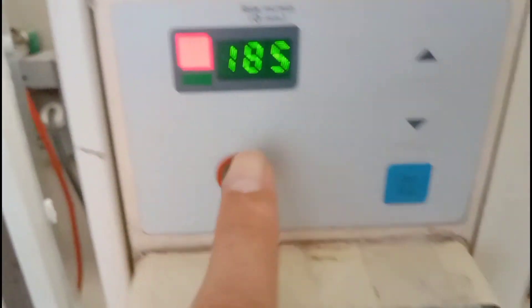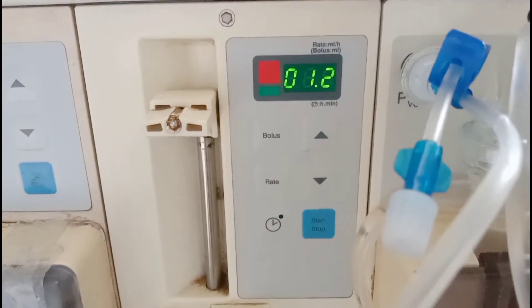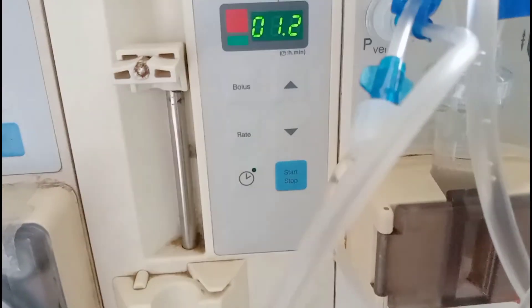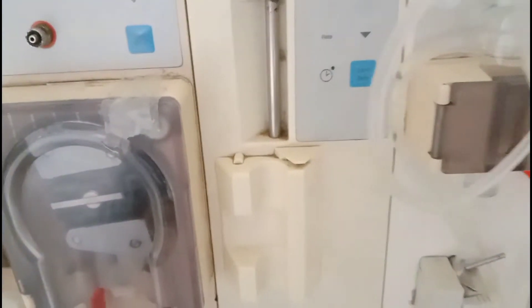Below this there is a start and stop button for the blood pump. These are the levels — you can start or stop the roller pump by this button. Then here is the heparin infusion port; you can set the rate of heparin in ml per hour in this setting.